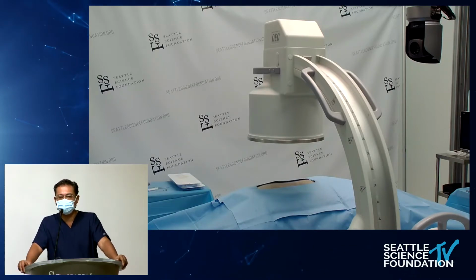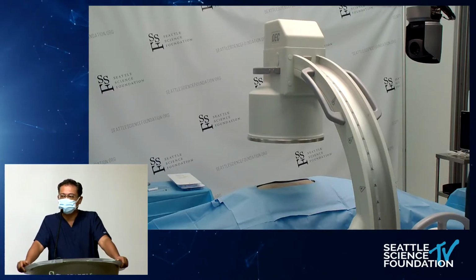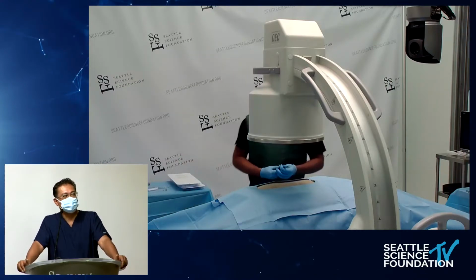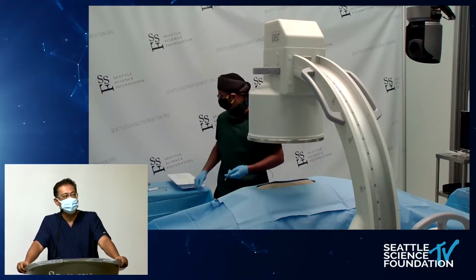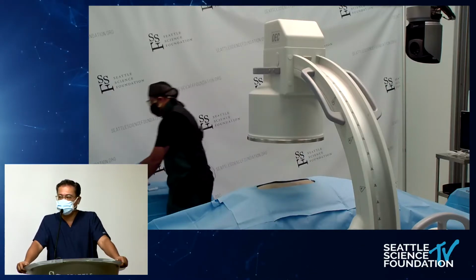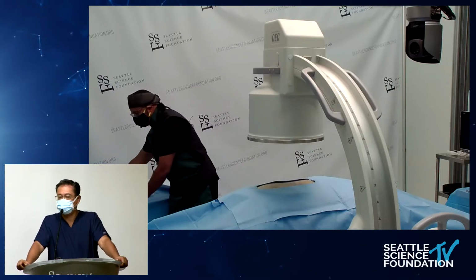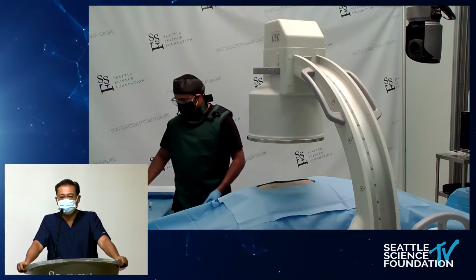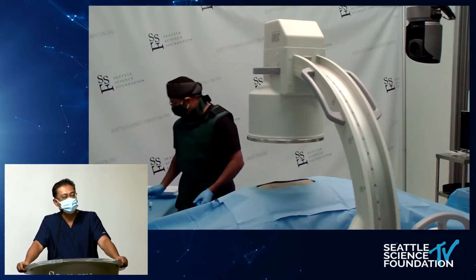Some of the key points I wanted to bring up: 30 degrees from horizontal, and 1.5 vertebral bodies below is where you enter. Make sure you use a lot of tools to keep your hands out of the eye of the fluoroscopy, because over a career of fluoro, you want to keep yourself and your staff safe.